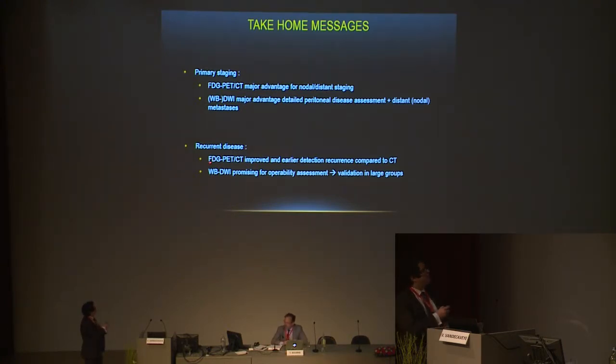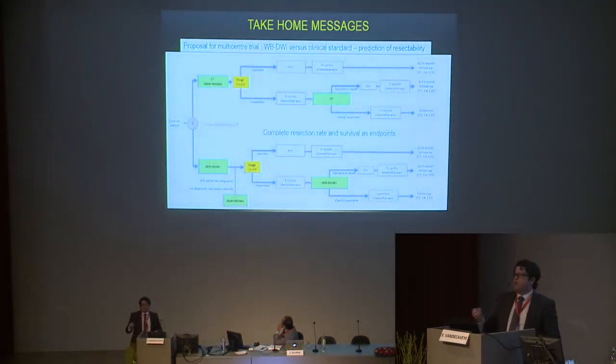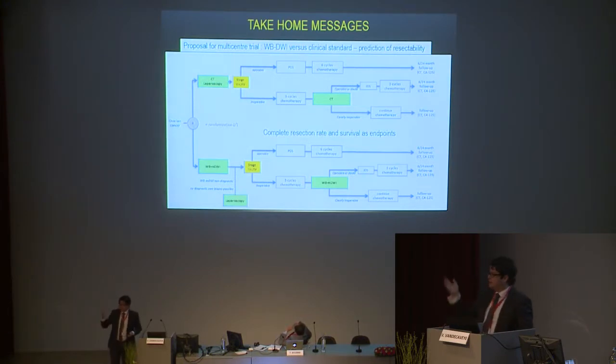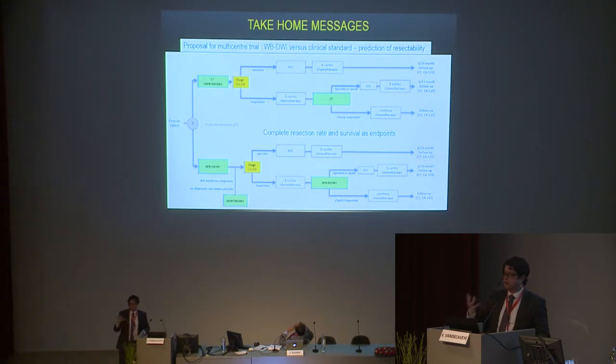For recurrent disease, FDG PET improved an earlier detection, and again, whole body diffusion probably has more a role to select patients who can have secondary debulking. So we learn a lot from gynecologists, also Dirk and the gynecological surgeons here in Leuven. I learned an extreme amount from these people, and it's really great to work together with the division of gynecology here, and that we can develop this kind of technique.